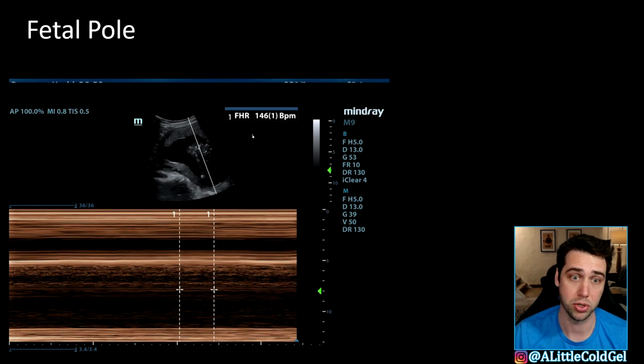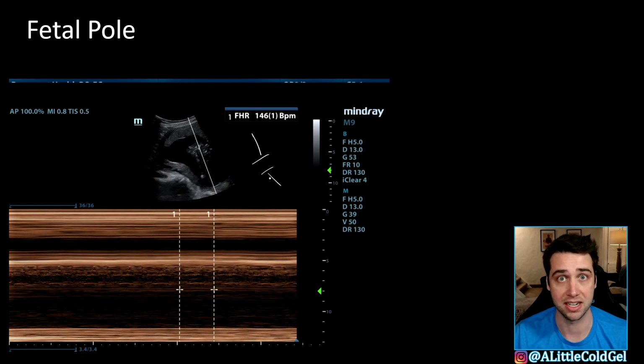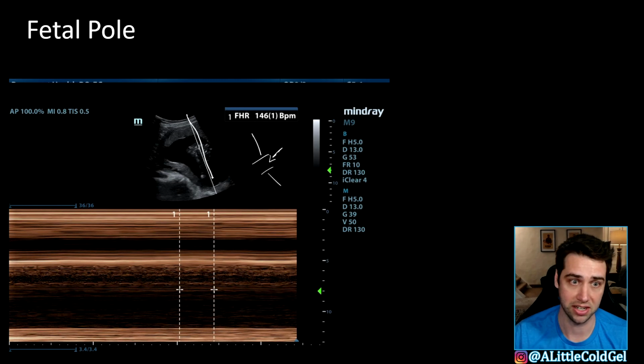And the reason is the pulse wave Doppler, the one that kind of looks like this, that gives you the dun dun dun dun sound. That one is actually heating up the tissue right in that pulse wave portion. So it theoretically could cause harm to the fetus. So we use the M mode instead, which is just drawing this line across the whole ultrasound image and then just drags that image out over time. So it doesn't actually increase the energy of the ultrasound at all.